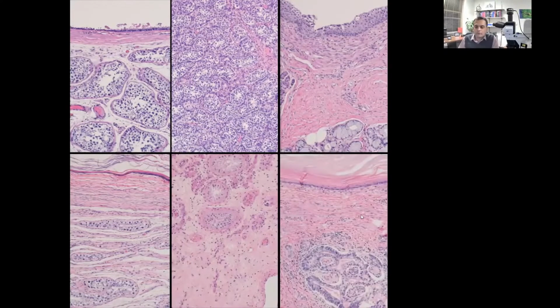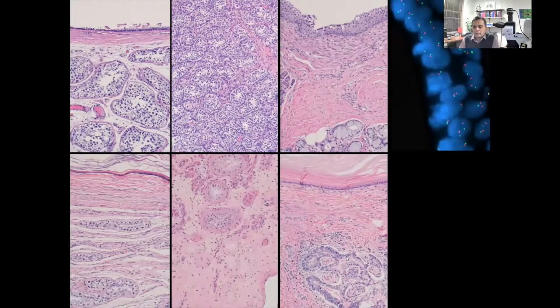In contrast, in postpubertal teratomas, you see these very ill-formed glandular elements that do not represent any forming organ. And you also see atypia, and if you look closely, you might see even some mitotic activity. So this is immaturity and atypia.